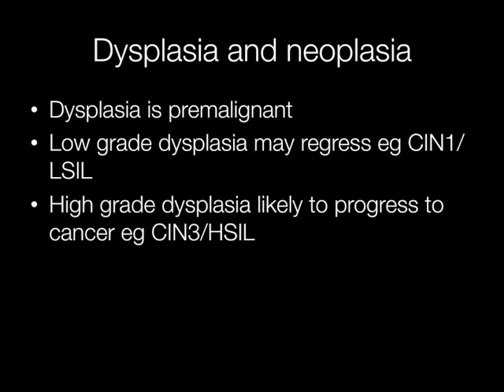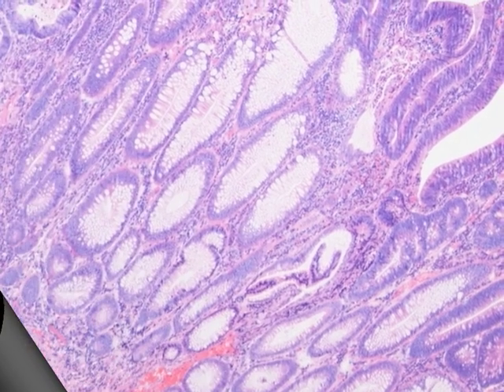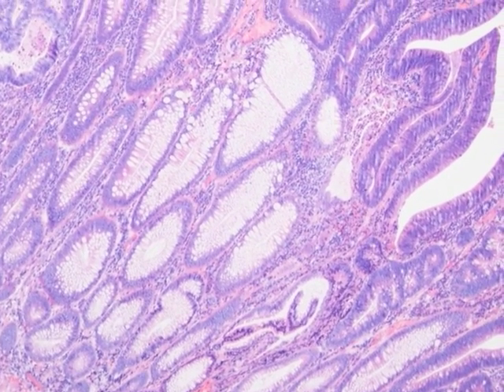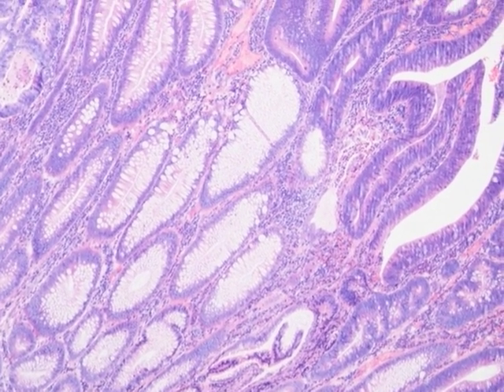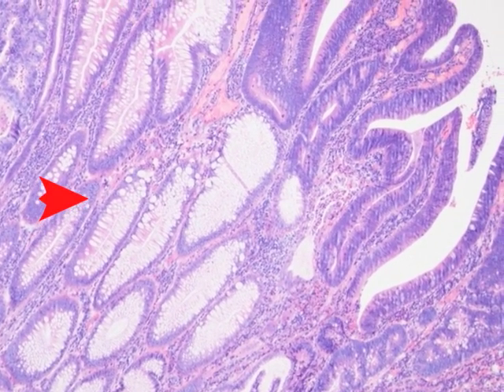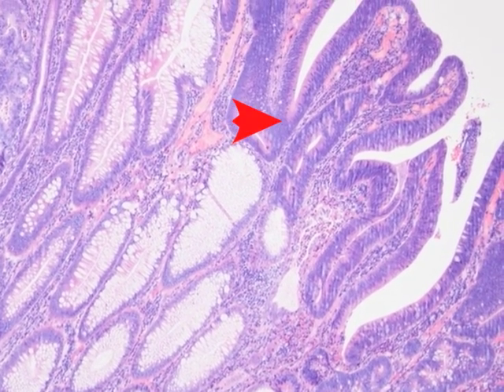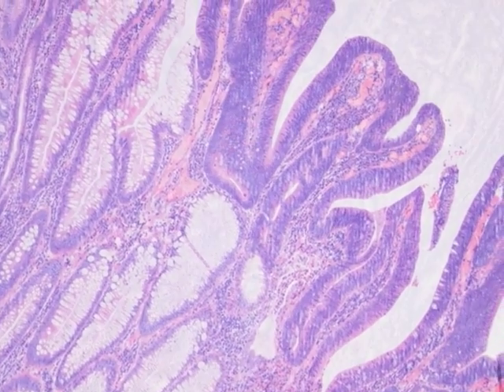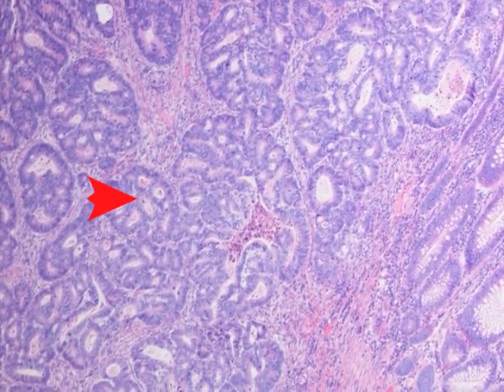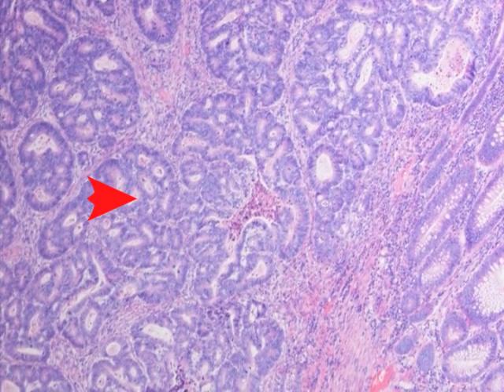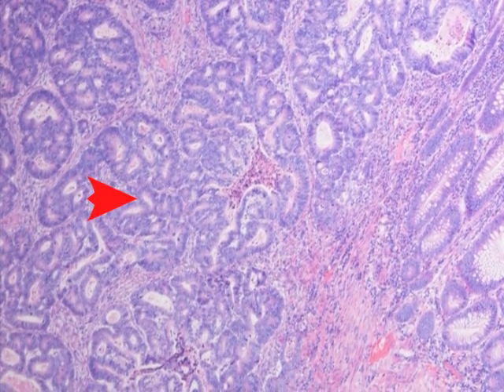Dysplasia is pre-malignant. The low-grade changes may regress, but high-grade or severe dysplasia has a significant chance of eventually developing into carcinoma. This is a tubular adenoma where you can see some normal crypts, some dysplastic crypts, and elsewhere there is a focus of carcinoma that has arisen in this polyp.